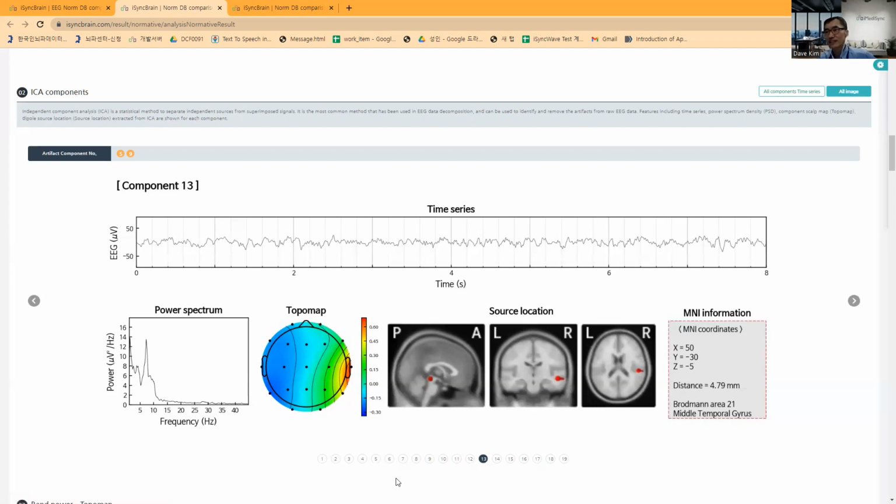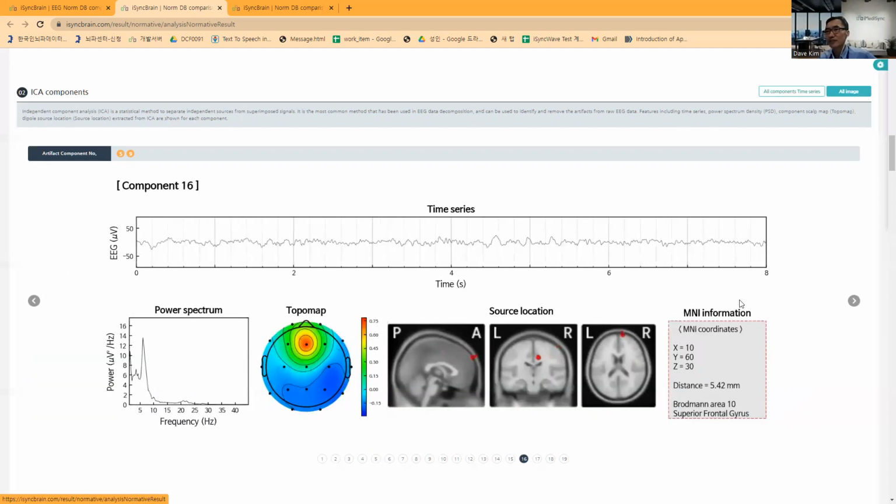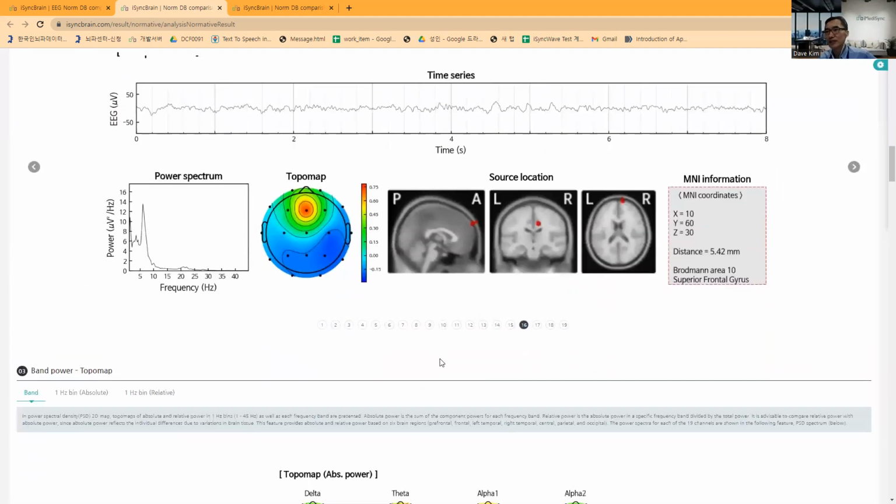In this case, the theta activity in the frontal and temporal areas is in the middle of the component, so the symptom is mild, I think. But basically the frontal theta and temporal slow activity is not a healthy activity, and we can associate this frontal slow activity with his ADHD symptom, basically.